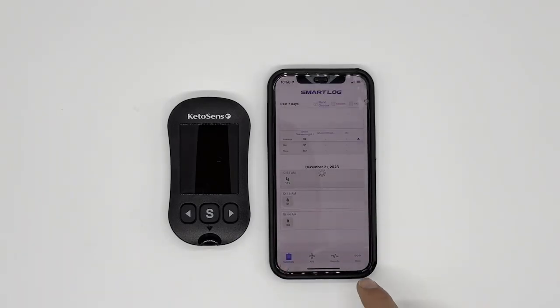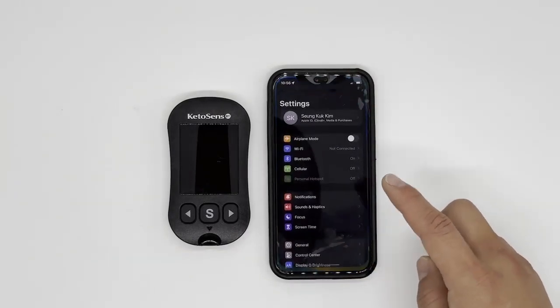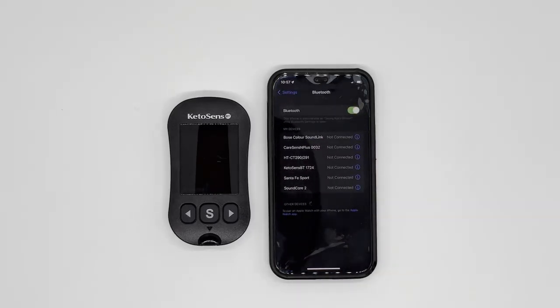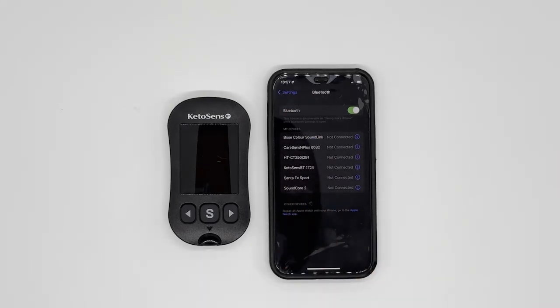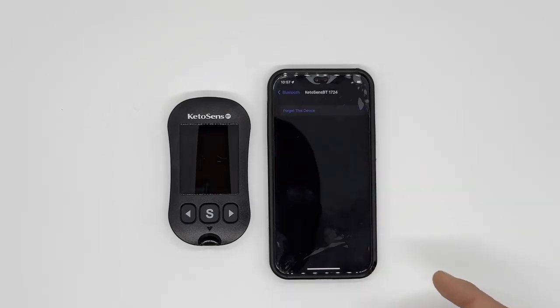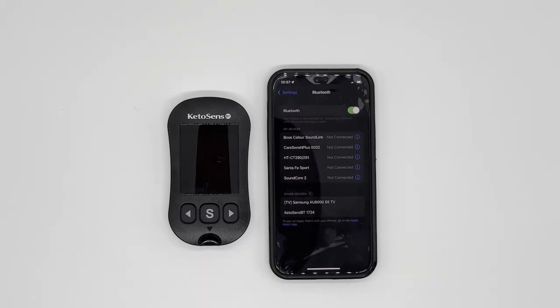Now let's go to your phone settings. When you go to phone settings, you'll see a section where you can see the Bluetooth paired devices. Under that list, you will see KetoSense BT with four digits. If you do not, that's completely fine. Make sure to forget this device from your phone, so this phone has no information about this meter whatsoever.